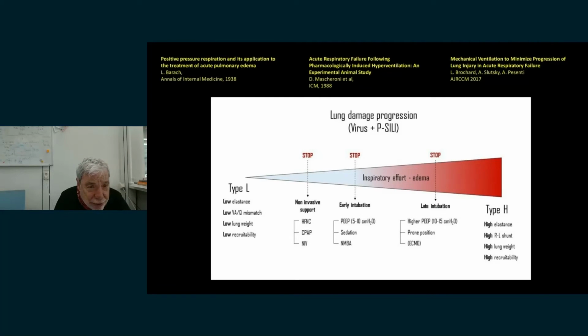I changed the motor, I changed the way I provide energy, but the big tidal volume is obliged in these patients, which have a tremendous respiratory drive. And of course, nobody measured it. The people were looking, but who was measuring the tidal volume, the stress, the strain in a spontaneous breathing patient?